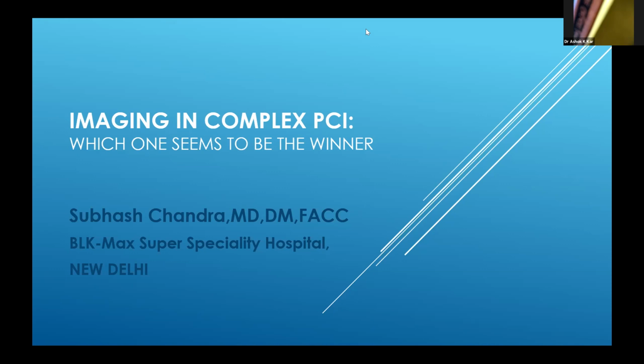Okay, thank you. Now we have to get the opinion from Dr. Subhash Chandra. Which procedure is better, OCT or IVUS? Right, sir. Thank you. After those two wonderful presentations defending each technology, what CHIP cases are has already been alluded to by Dr. Sahu. And this question by Dr. Kar was very relevant: should you use these technologies in day-to-day practice? The answer was no, because of various reasons. Cost is one in the Indian context, followed by the volume which we deal with. But nevertheless, complex and select cases with long lesions, bifurcations, CTOs, or calcified lesions should definitely be augmented by the technology we're discussing here.